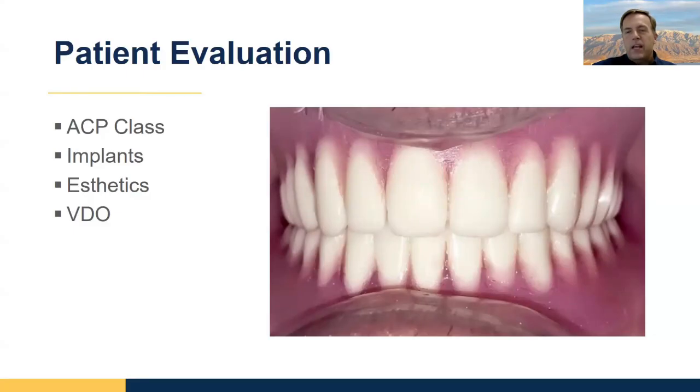And again, the VDO, very important. A lot of these patients are missing some vertical dimension of occlusion, and we can easily restore that during our digital process.